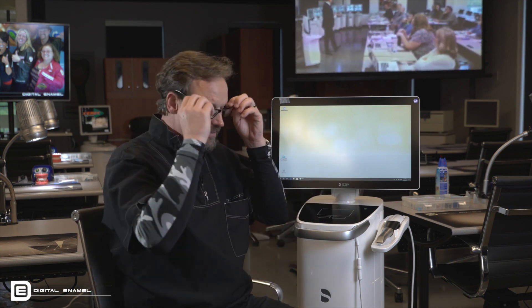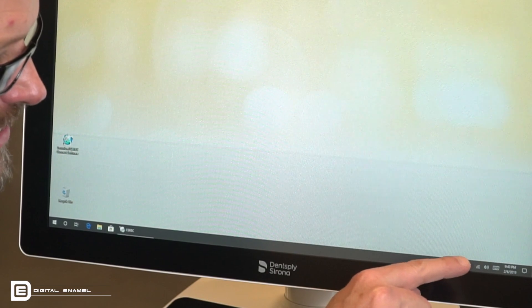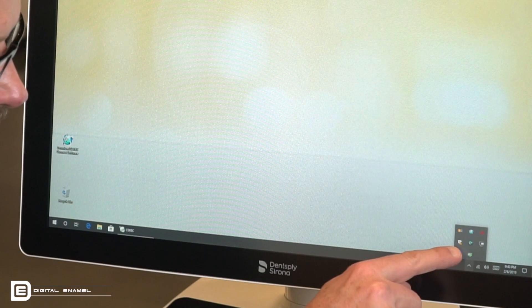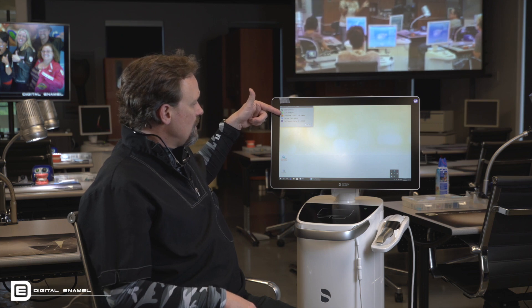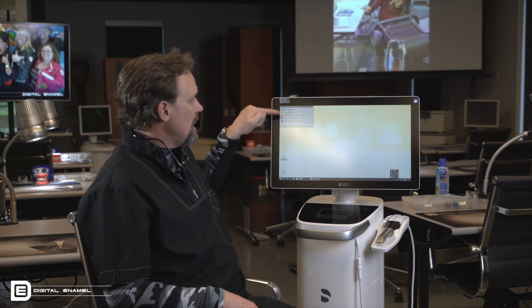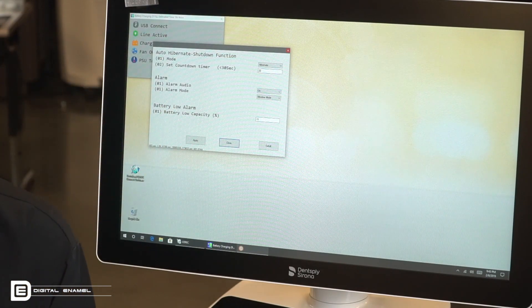I've got to put my glasses on — I'm 50 this year, so I need readers unfortunately. You click the icon with the little arrow going up, and then there are other little icons. There's one that looks like a battery with a plug on it. When you get that, it will show the connection of the battery and the estimated time that it can be used, and how much it is charged. If you hit the settings button, you can have more control over the alarm and things like that.